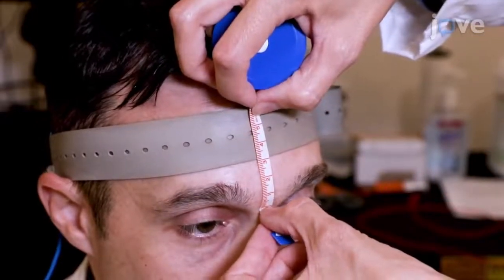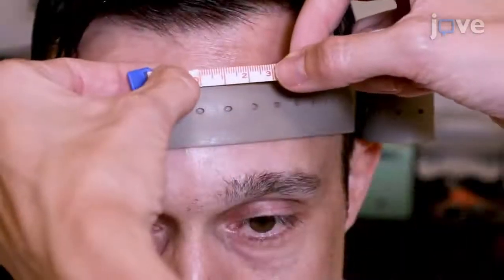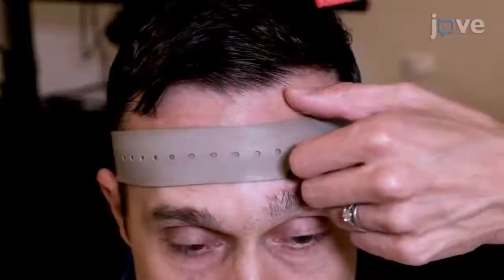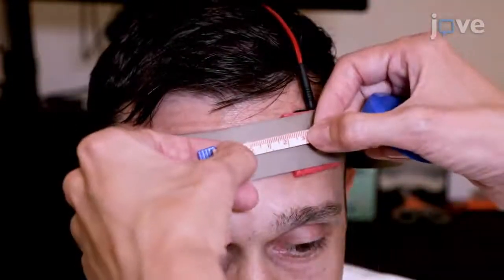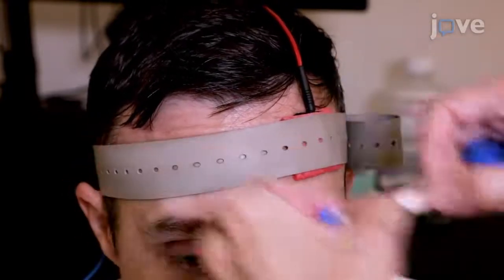To establish the location for the anodal electrode, measure out the previously calculated 10% of head circumference from the nasion up, and the previously calculated 5% of head circumference to the right. Place the anodal electrode, and verify that the anode is touching the 10-20 EEG electrode AF3 FP1 locations.